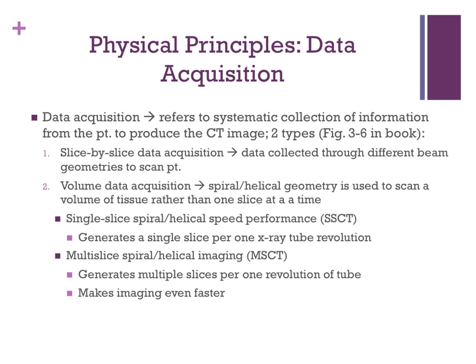CT can be described in terms of physical principles and technological considerations. The physical principles involve mathematical concepts to understand the way the image is produced, and the technical considerations involve the practical implementation of scientific and engineering principles, such as computer science and technology.